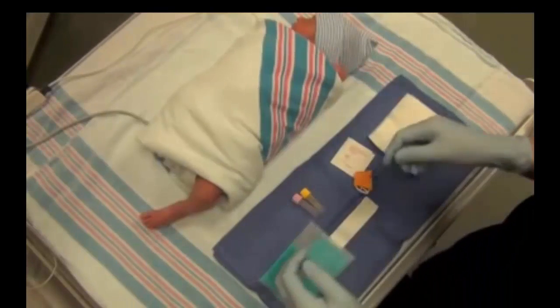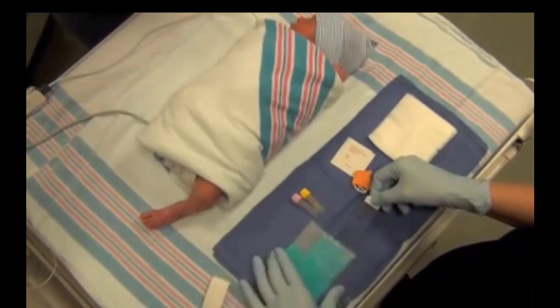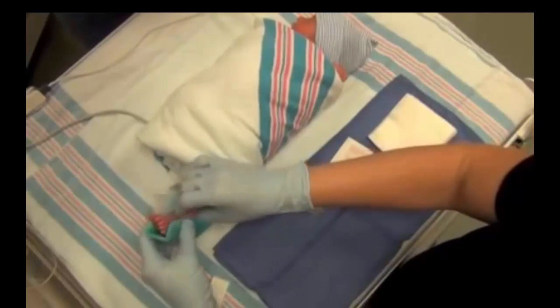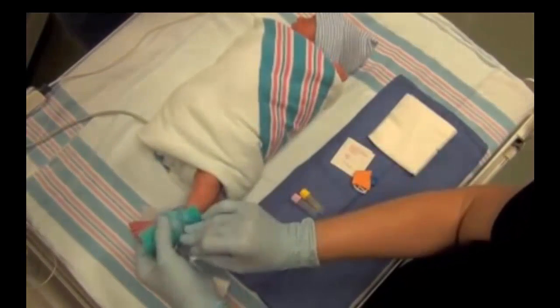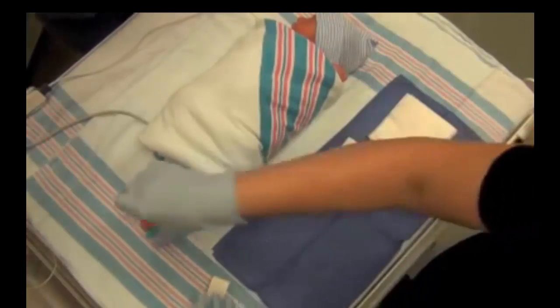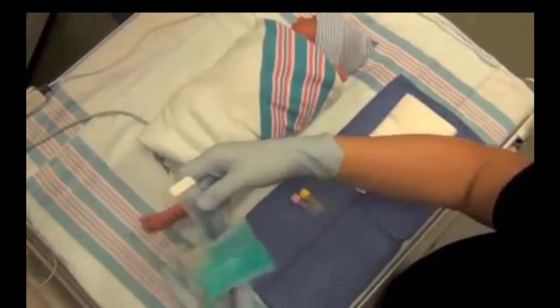The infant's identity was assessed by utilizing 2 of the approved JACO identifiers, and the blood sampling necessity was confirmed with the medical provider. A heel warmer was in position for 5 minutes, and oral sucrose was administered for 2 minutes prior to initiating this video recording. A heel warmer is being utilized for visual confirmation of the appropriate application.